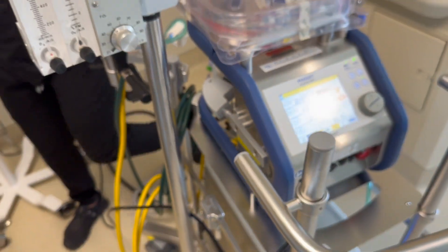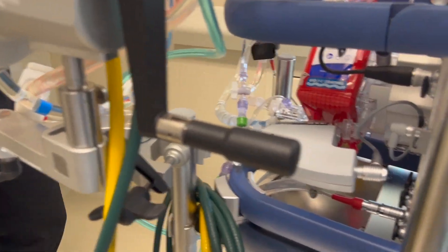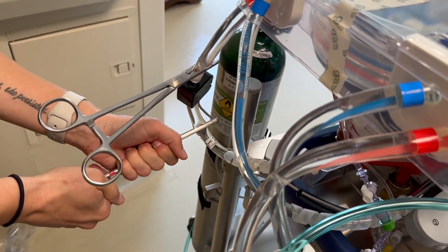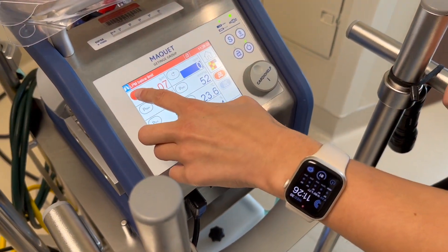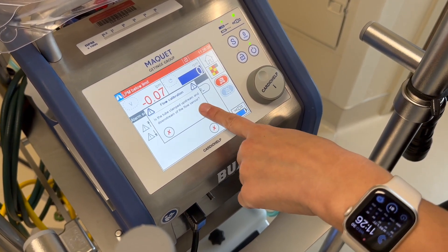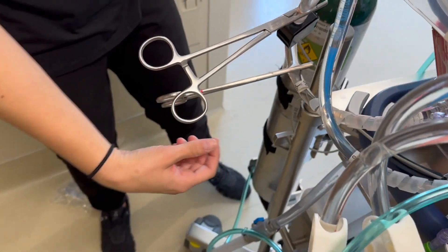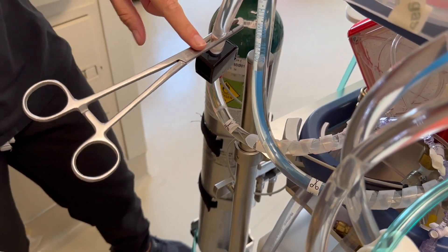Now take your two tubing clamps and clamp above and below your flow probe — one above and one below. Then zero your flow probe: hit your flow zero button. It will ask if it's clamped — say yes and green check it. Then remove the clamp closest to the oxygenator and keep the other clamp in place.